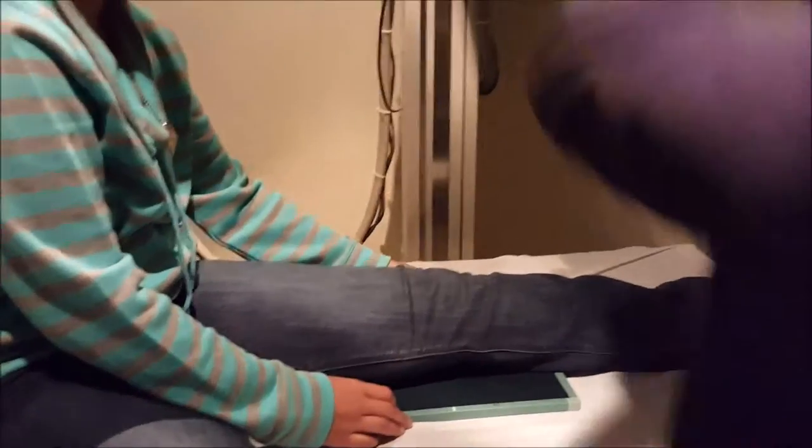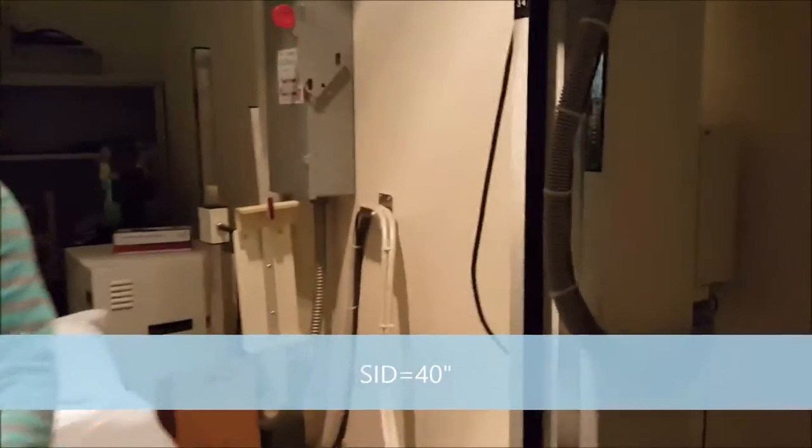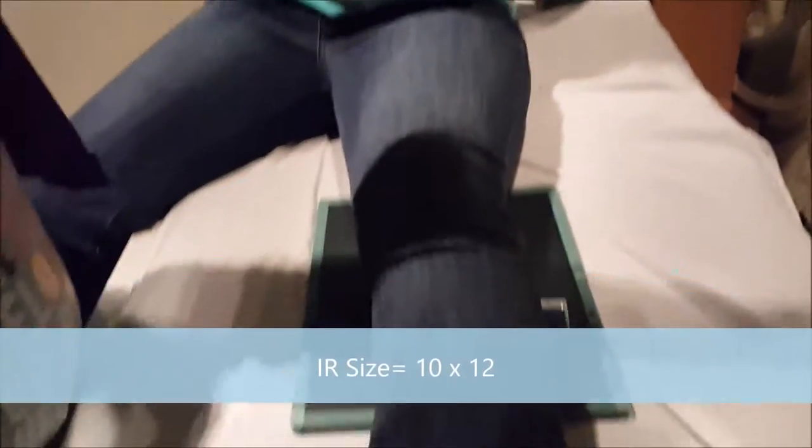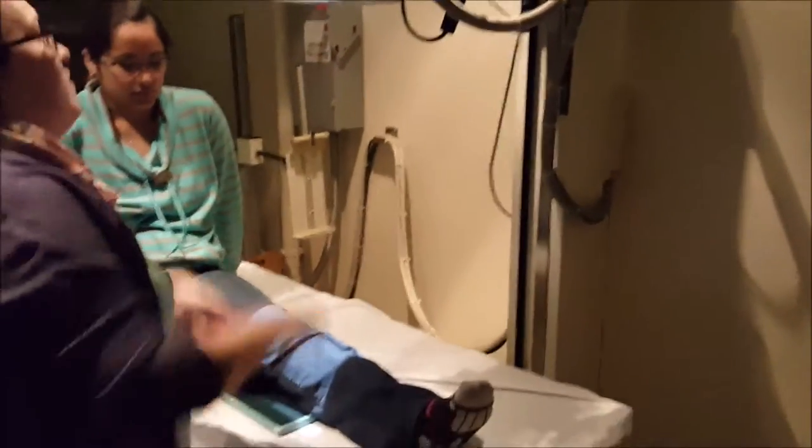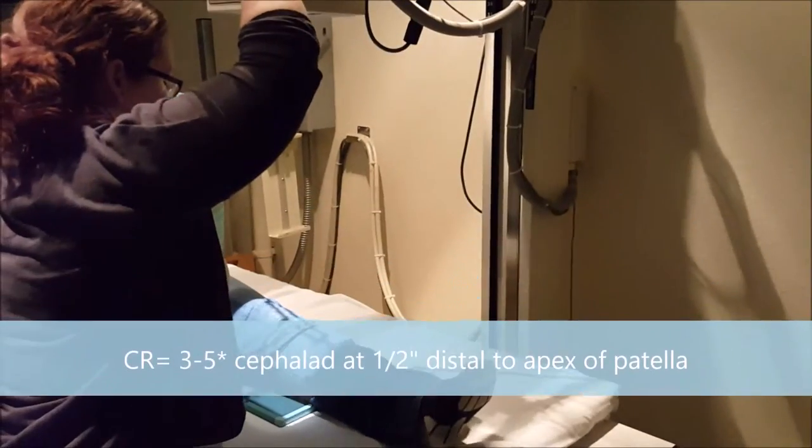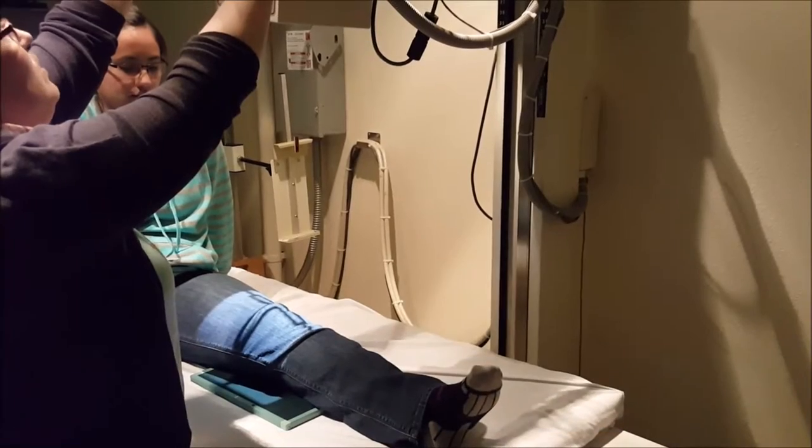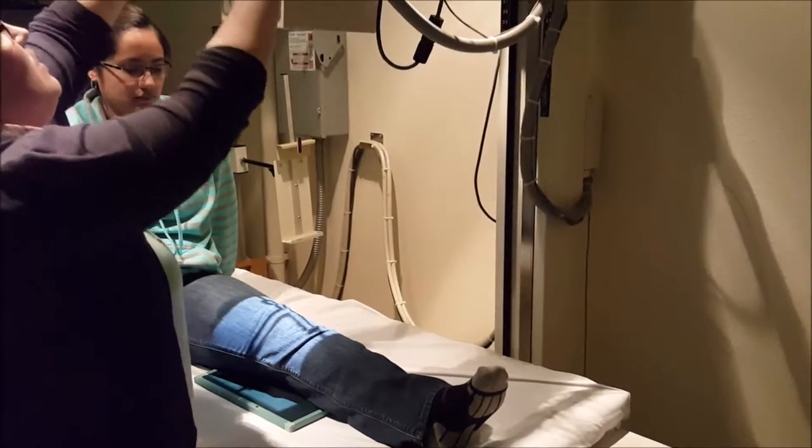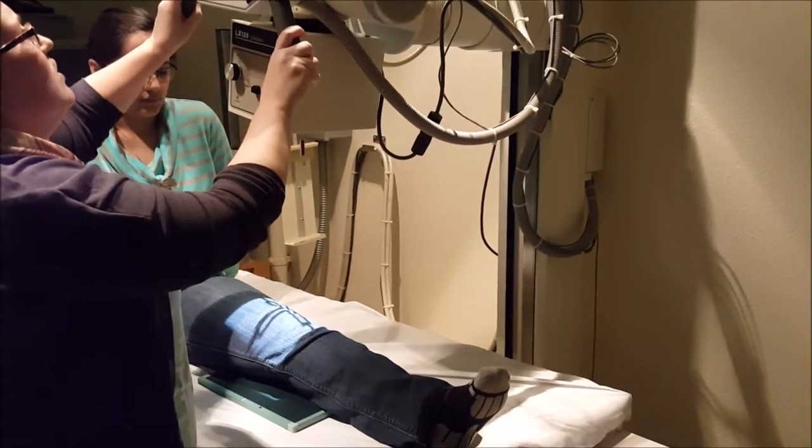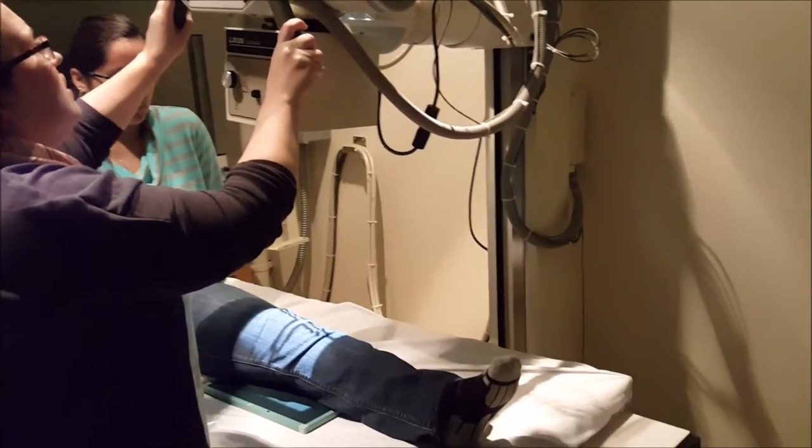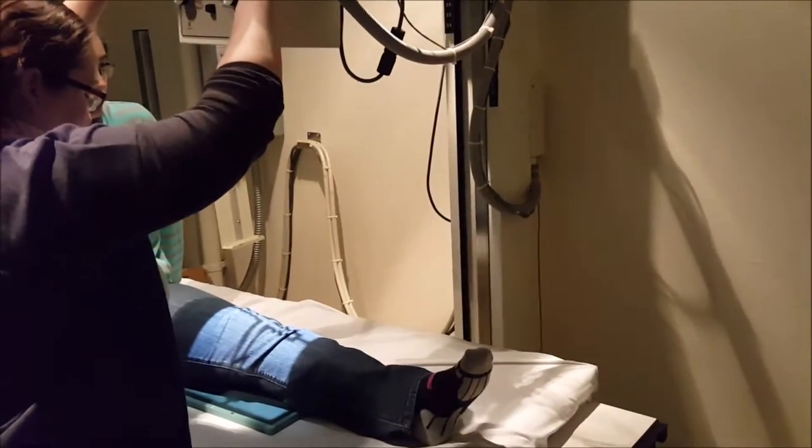For an AP knee, we're going to be at a 40 inch SID. We're going to use a 10 by 12 cassette. Now in your book it talks about different thicknesses of the knee at different angles. Most adults, you're going to use a 5 degree angle on. Sorry I'm short and I can't see. That's 5 degrees.